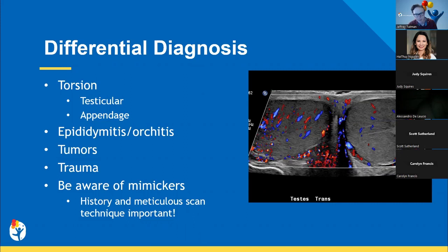I have an example image on the right side of the screen here. Some of you may know Paula Woodward. She was one of my attendings when I was a resident at University of Utah. She was also one of the oral board examiners, and she used to give us our internal oral boards. She would show us a case very similar to this one, put it up on the screen and ask us to start talking about it, without giving us any history. What she really wanted us to ask was, what is the side of the patient's pain?